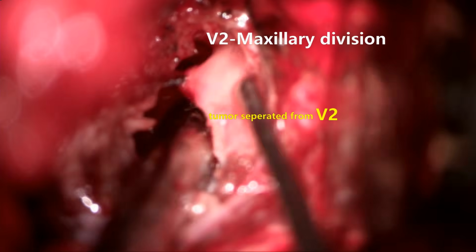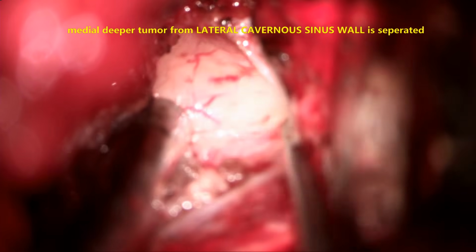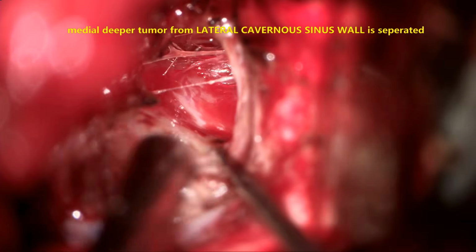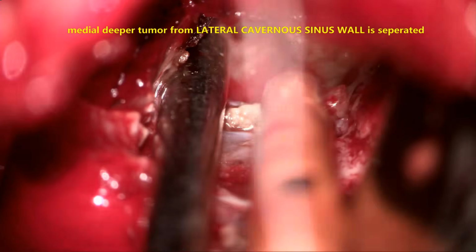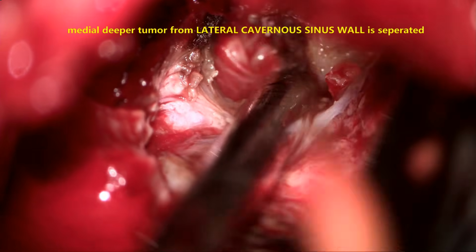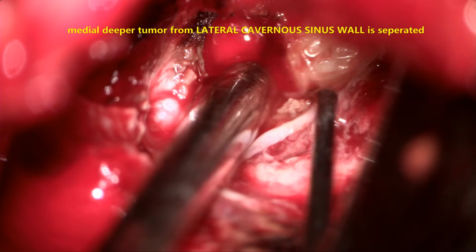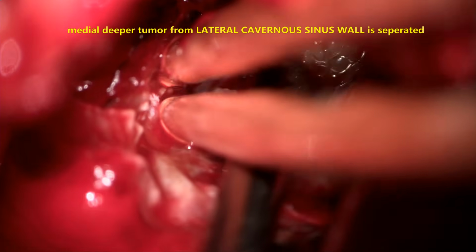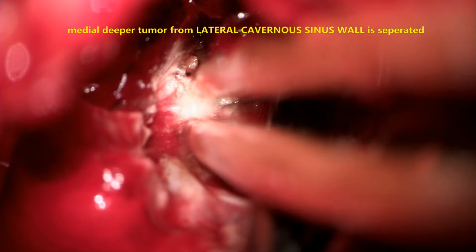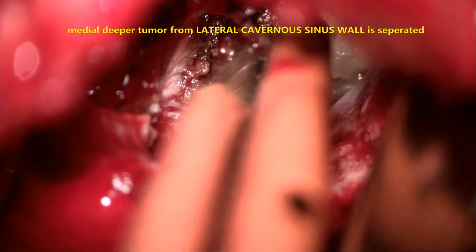There is irregularity, and you can see the nerve is irregular, and gently this is being separated from there, and you can see a few fascicles entering the tumor, and the tumor is separated and removed from the second division. In that bargain, we may injure or damage a few of the nerve fibers from where the tumor is originating, but the majority of the time you can preserve the nerve root in these cases.